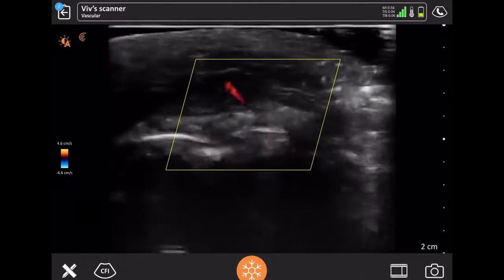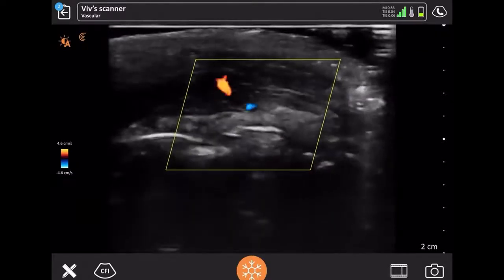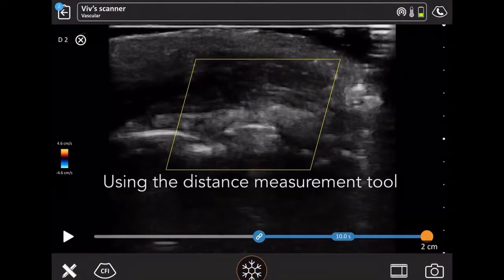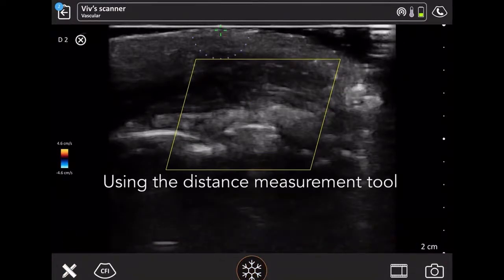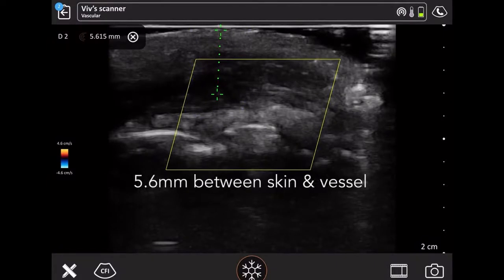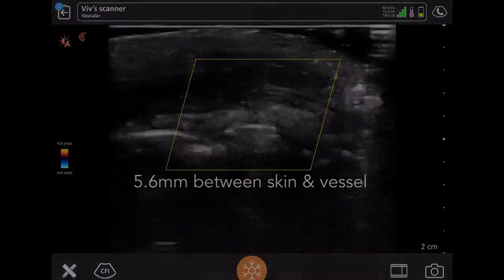The vessel runs like a snake around the top lip, and it's difficult to know where it is without using an instrument like an ultrasound scanner. So in this case I measured following the scan. I can take a shot of the image, save it, store it, and yeah, 5.6 millimeters between the skin and the vessel. So I'll stop this video and I will get Sunny on.